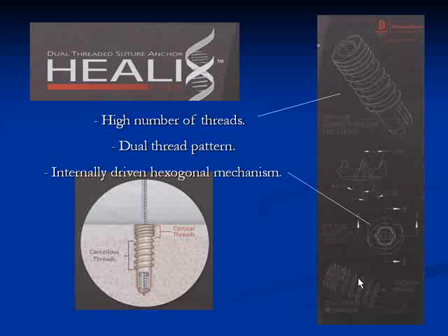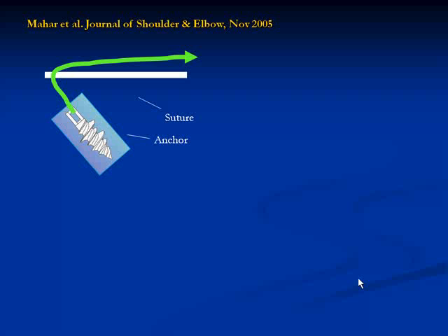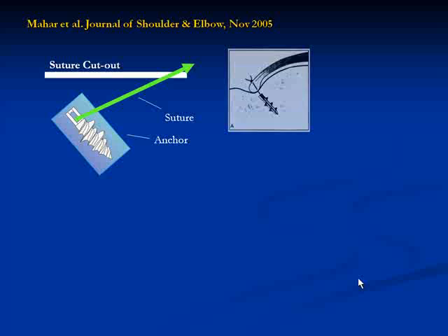And this addresses some of the important considerations with some of the more conventional anchor designs. The more conventional anchors require being inserted fairly deep in the bone, in the cancellous bone. But what can happen is that with loading, the suture can cut through the bone as it seeks the shortest path between the 2 points. And as a result, there can be gapping at the repair site.